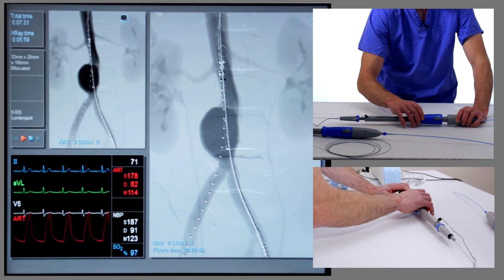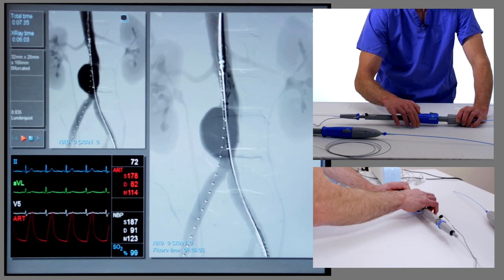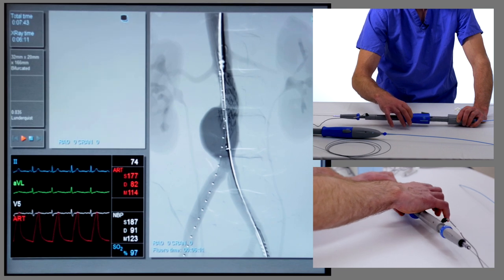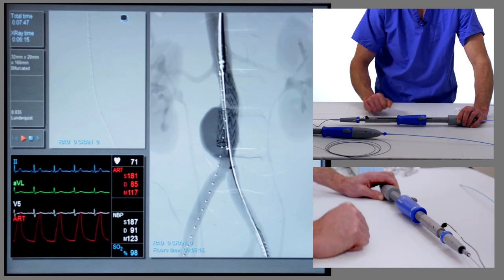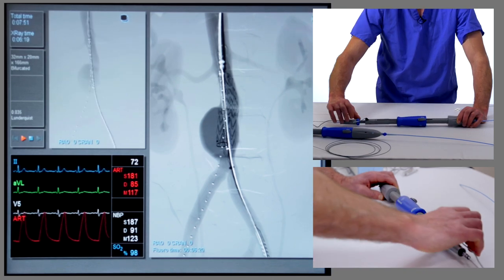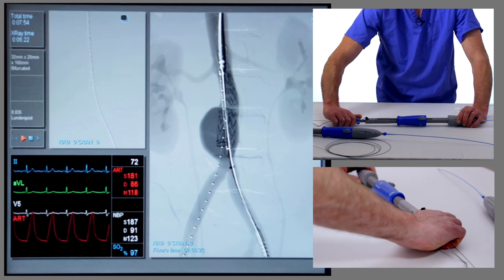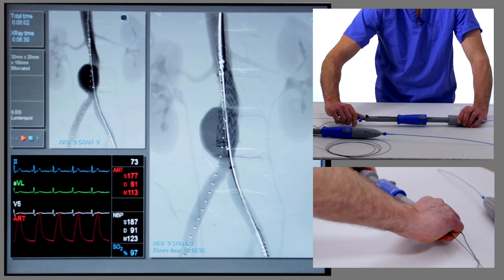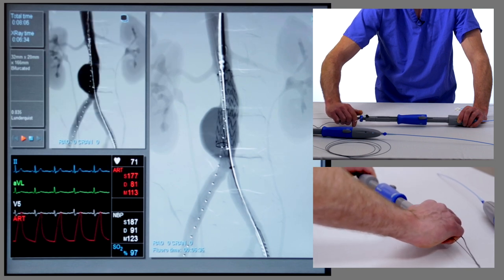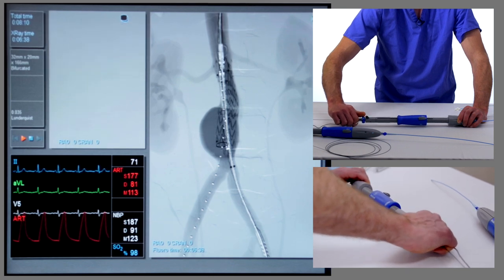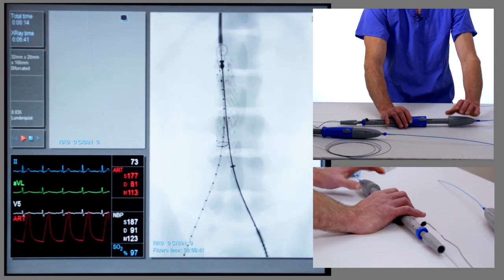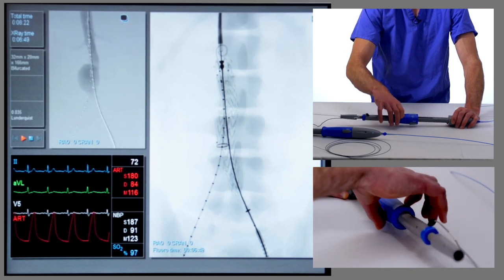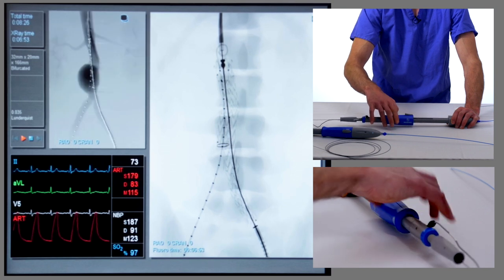We can see the outer sheath coming back and the graft will start to open now. The key at this point is to keep the graft stable in the correct position until the contralateral limb gate is opened. At this stage we've got blood flow through the graft. We're now going to release the proximal uncovered stent by rotating the blue handle at the back following the direction of the arrows. You can see the proximal uncovered stent with the fixation hooks is now open. We take that all the way, remove the overlay — we're happy with the position — and fully deploy the main stent graft. That's fully deployed.